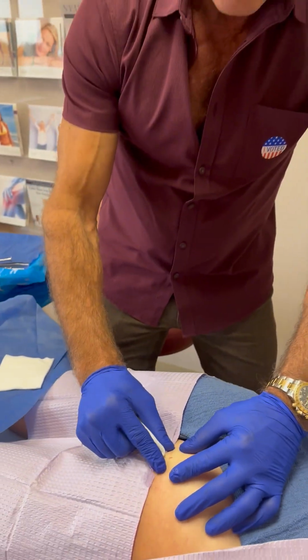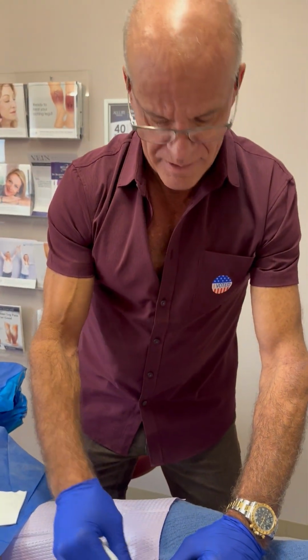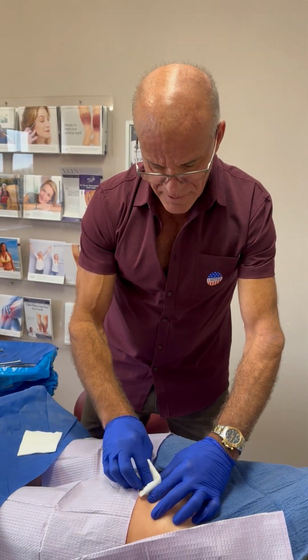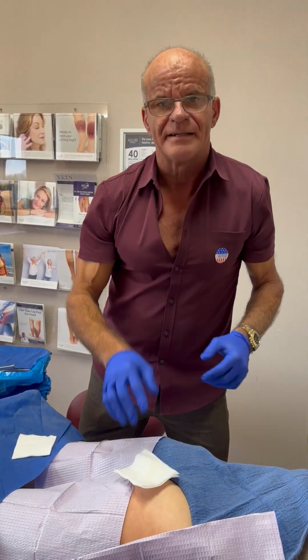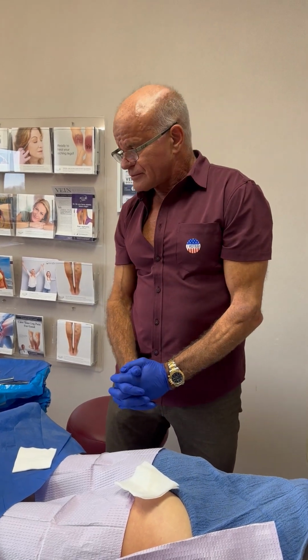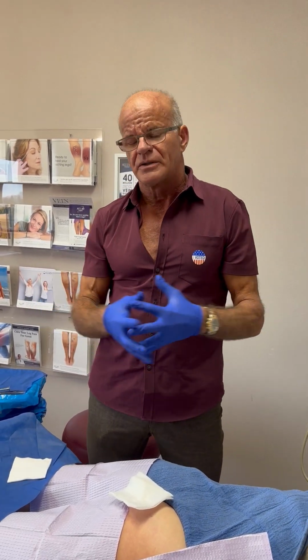And then I put a little steri strip on here, which is basically a little tape. Doesn't need a stitch at all. And it'll heal up. And she's had several pellets before. I can see a little mark right there, but typically you cannot see the scars. The pellet kicks in about 2 weeks or so.